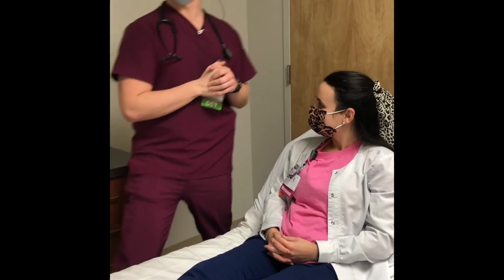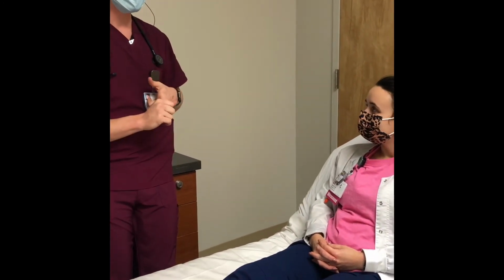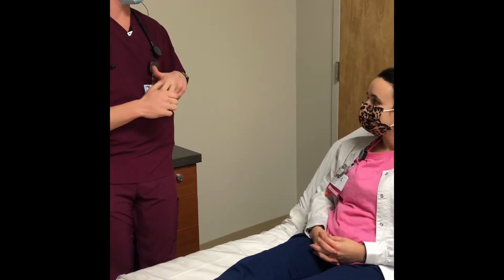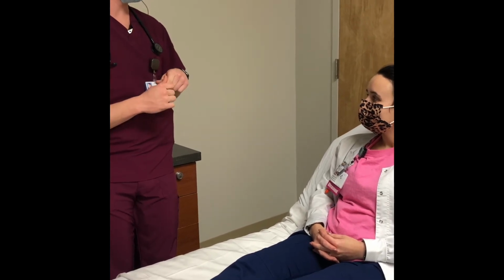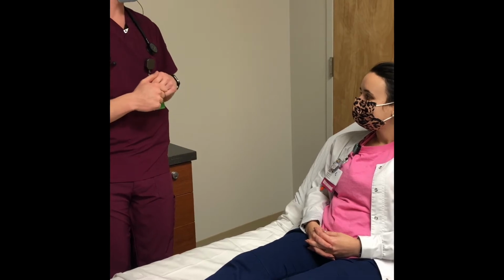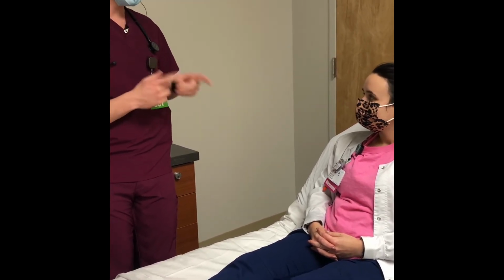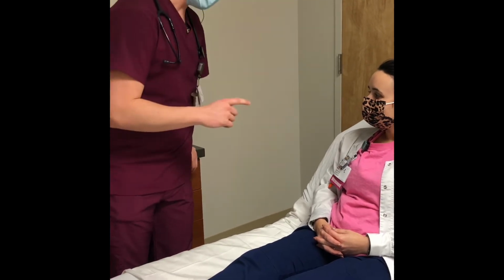I'm going to be your nursing student for the day. The provider has asked me to do a cardio and respiratory assessment. I'm going to start off by asking you a couple questions, and I'm going to listen to your lung fields as well as listen to your heart, make sure there's nothing irregular going on there. But I'm going to start off, what is your name and date of birth?